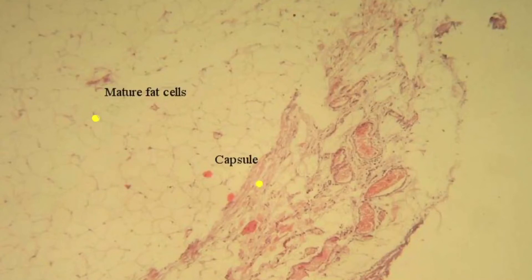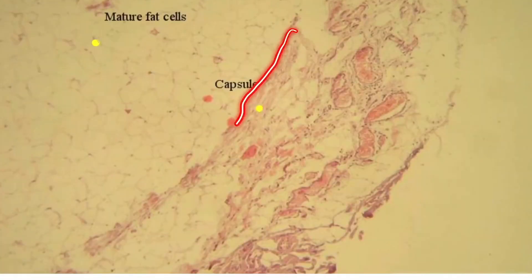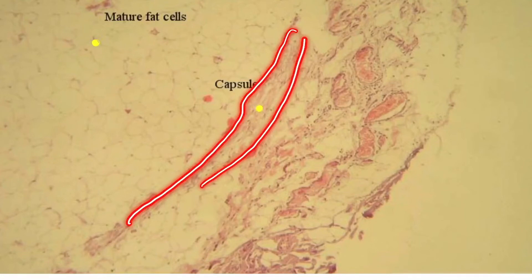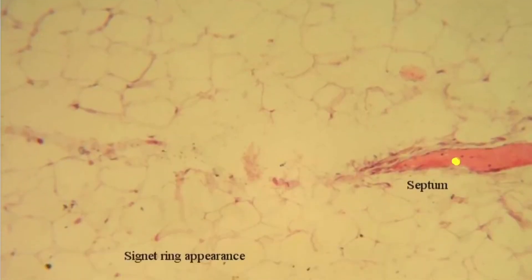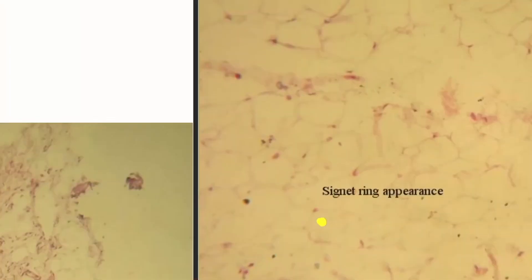And here is another cell where the nucleus is placed not in the center. Next, here you can see a capsular layer, the capsule. Here you can see a septum also, fibrous septa.